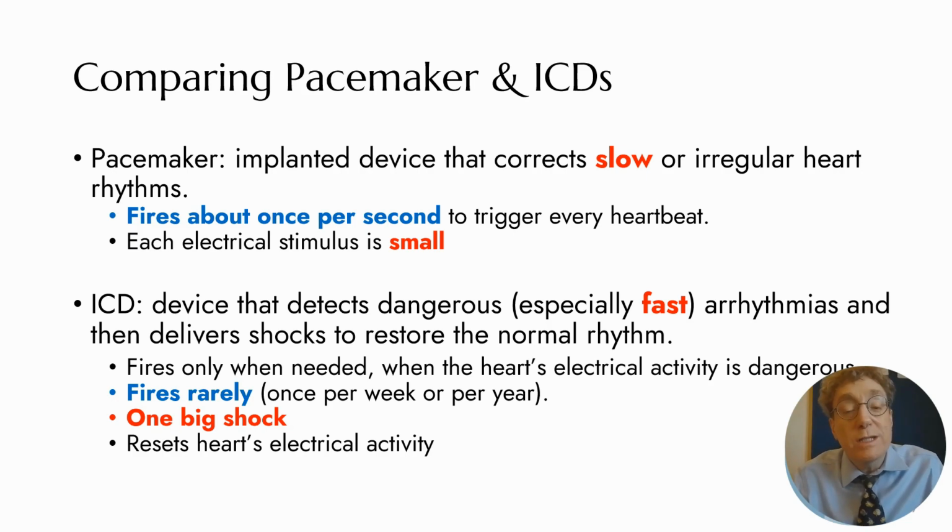So again, let's compare pacemakers to ICDs, or the defibrillation function. A pacemaker is an implanted device that corrects slow or irregular rhythms. It fires about once per second in order to trigger each and every heartbeat. And each of the electrical stimuli that comes from the pacemaker is small. Compare that to the defibrillation function, the ICD.